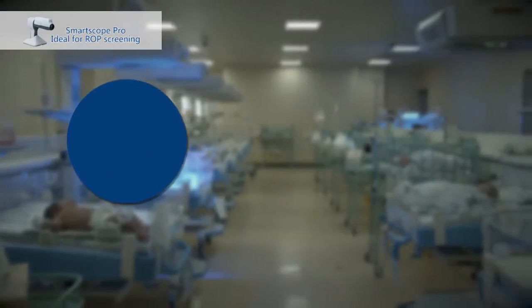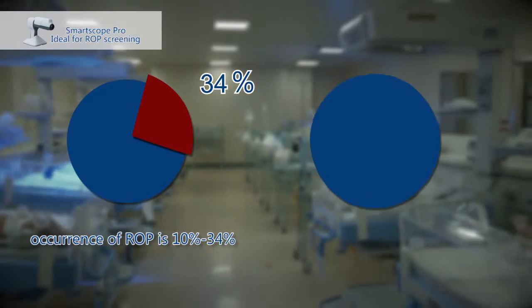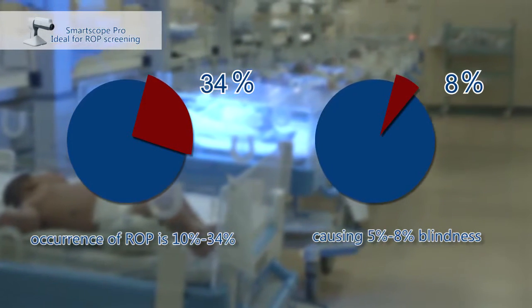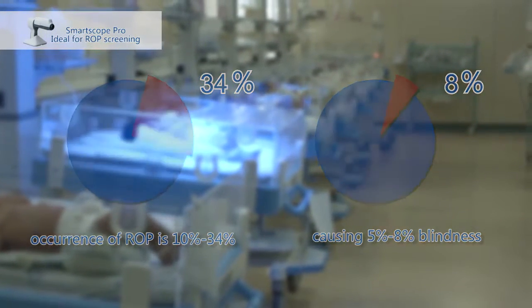The occurrence of ROP in premature infants is 10% to 34%, causing 5% to 8% blindness in children. ROP has become the most common cause of blindness worldwide.